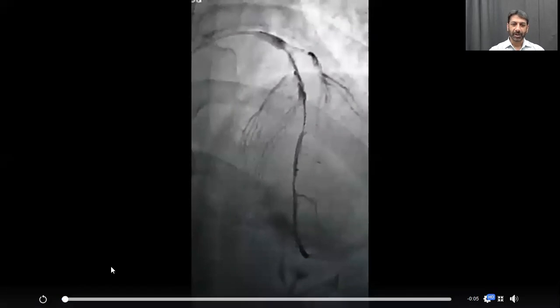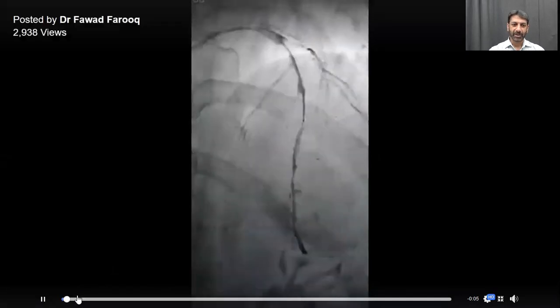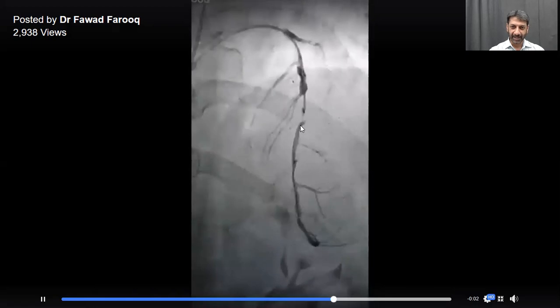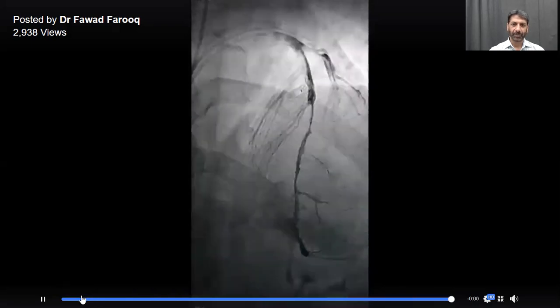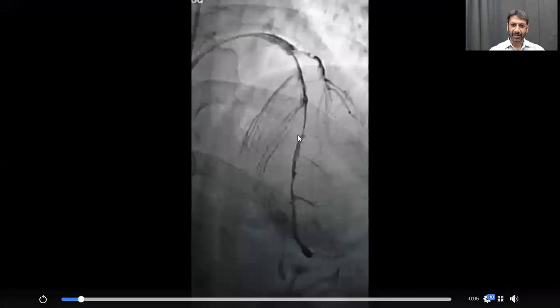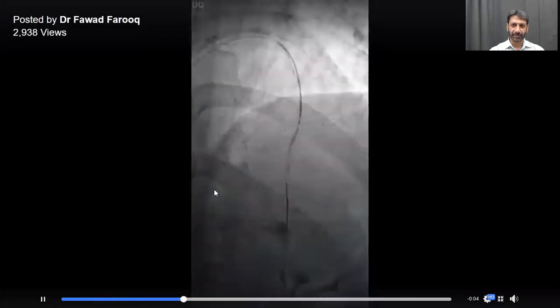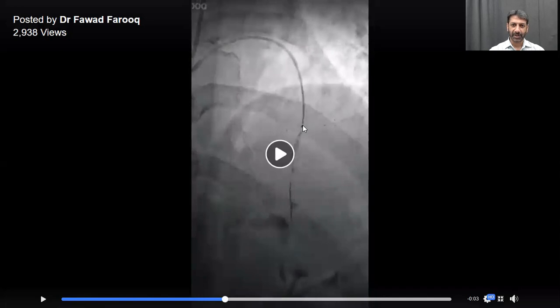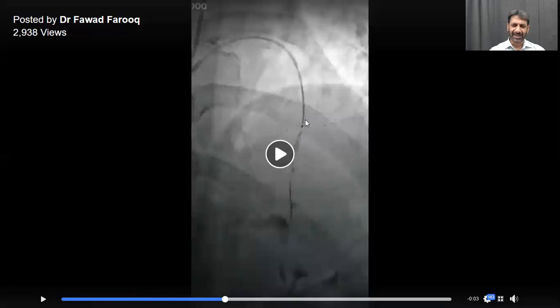Why do we do that a number of times in such situations? The dye is coming from here — that's the place from where the dye is coming — this is the aspiration catheter. We use this to give dye because in acute anterior MI, like in this patient, in spite of aspirating and in spite of slight ballooning — because you want to avoid ballooning in ST elevation because of no-reflow.